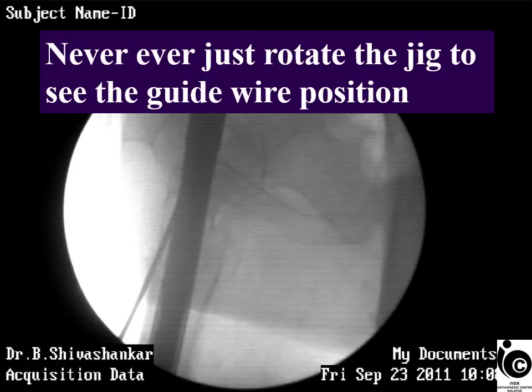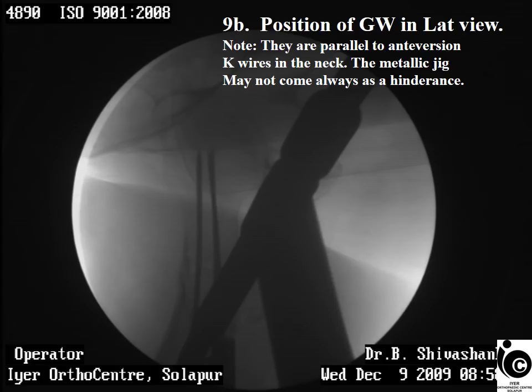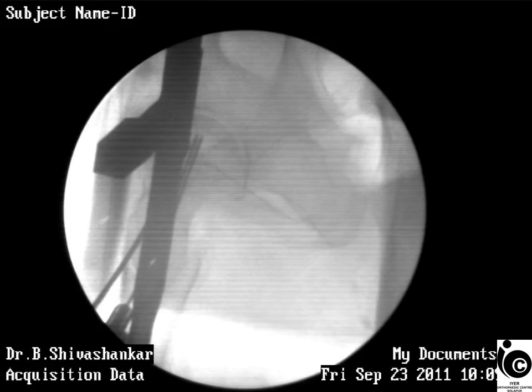As long as you can see the anterior cortex and the posterior cortex, the head properly, that indicates that your guide wire is properly positioned. Don't just rotate the jig to see the position of the guide wire. Many a time the jig only moves and the guide wire, which is already within the head and neck, bends at the junction of the entry into the bone. As you can see, the jig has been rotated, the guide wires are bending.